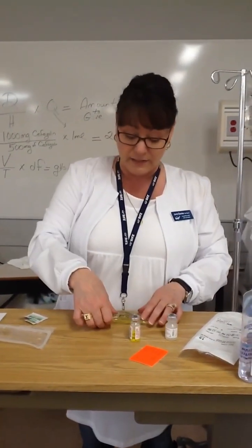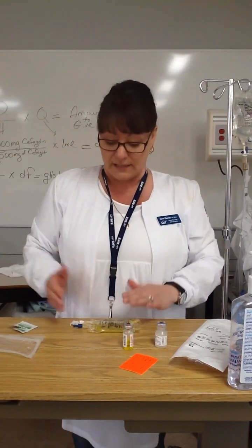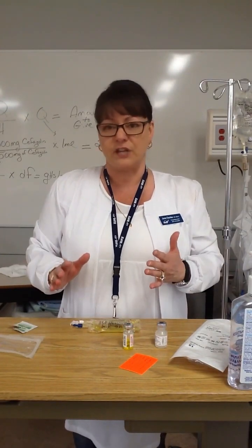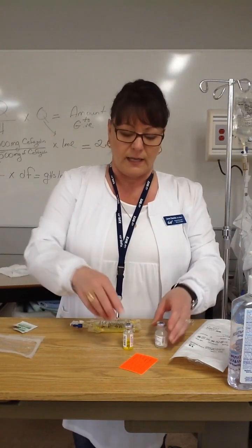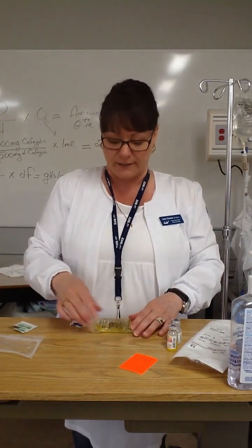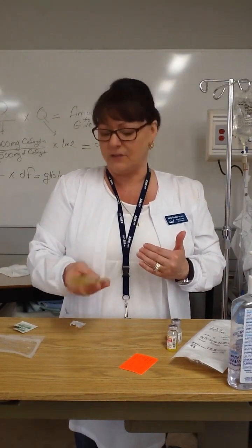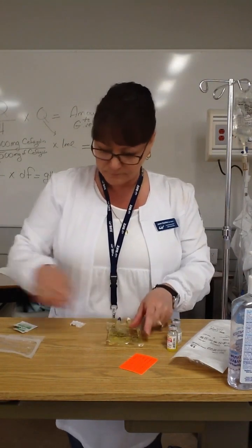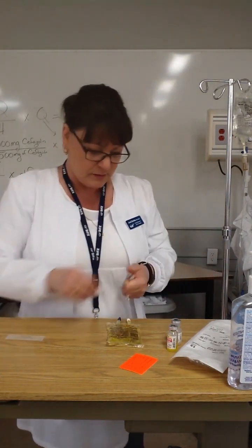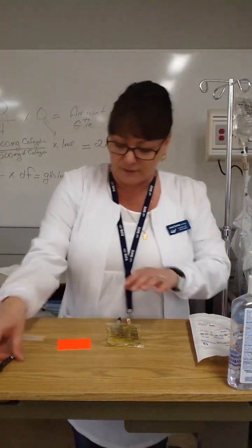So I now know that I have very safely, accurately, and completely prepared that medication and added it to the second bag. I've done all my 3 checks. I've had a second nurse check my work, and I'm pretty happy with that. So you can get rid of that vial once you've completed that 3rd check. Just rock your secondary bag gently back and forth. Don't shake. You can get rid of your garbage while you're doing that. Then I'm going to fill out my little label.